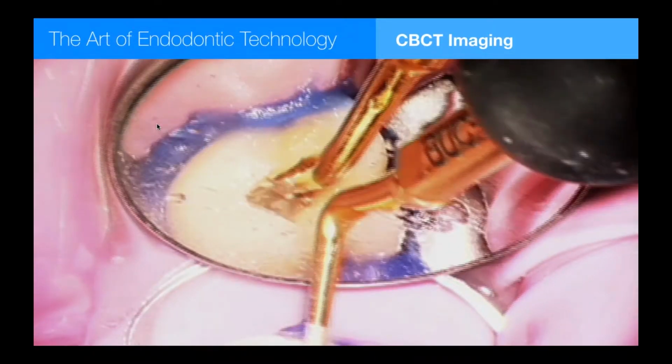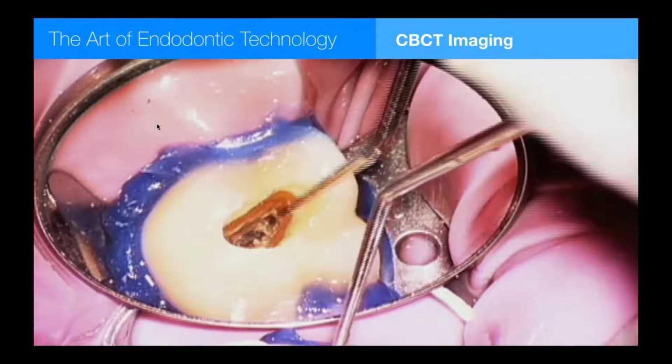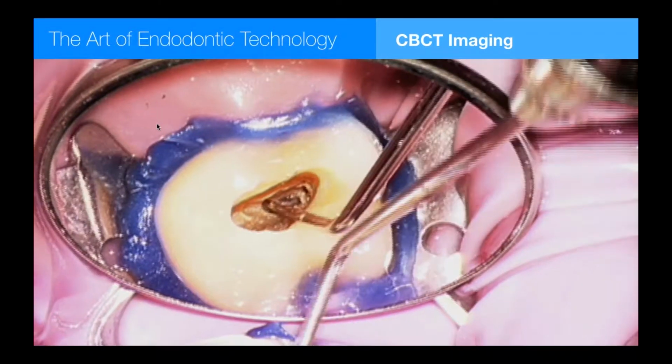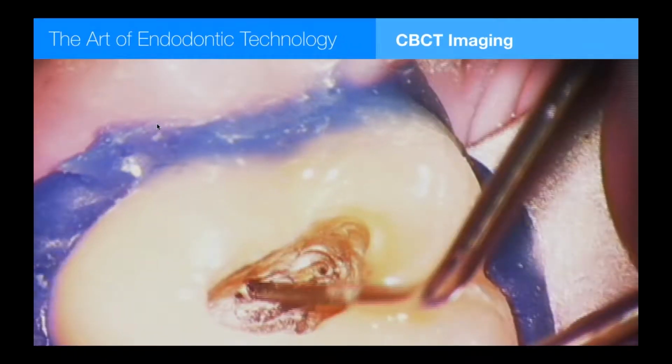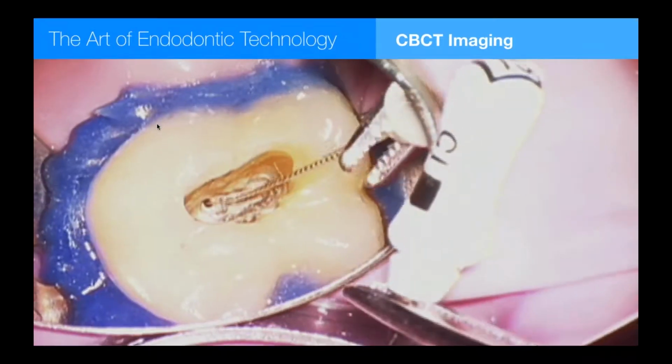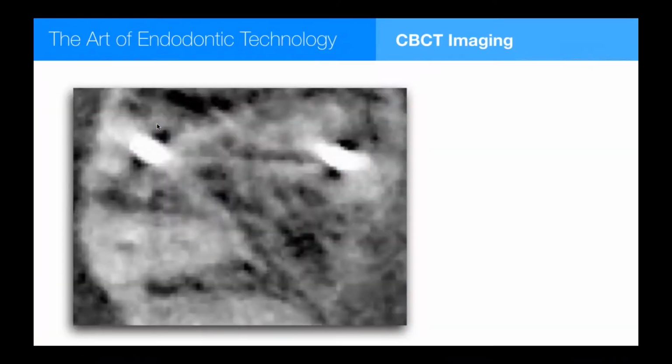So finally, frustrated, not having any success, I'm thinking, what am I going to do to get in here? And I hadn't considered it before, but finally I realized if I took a cone beam CT volume right now, I could see where I cut. I could see where the canal is and maybe connect up and find the relative position. So here is, it's a little blown up, but we see an axial view of this tooth after I treated the distal buccal and the palatal.